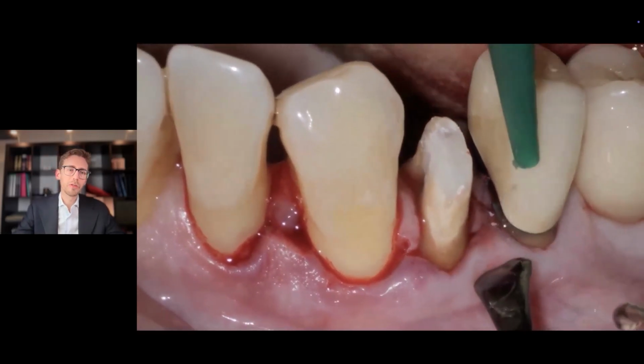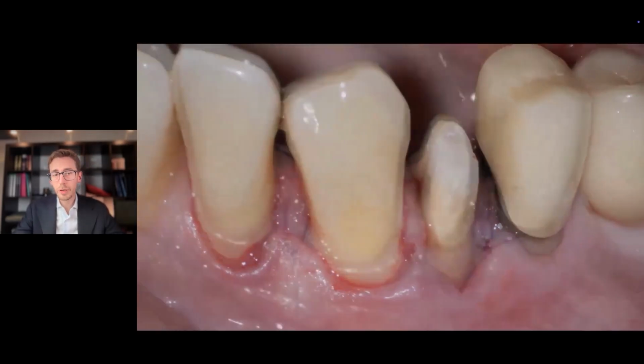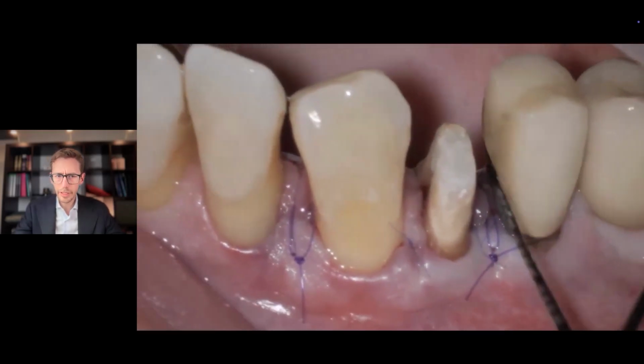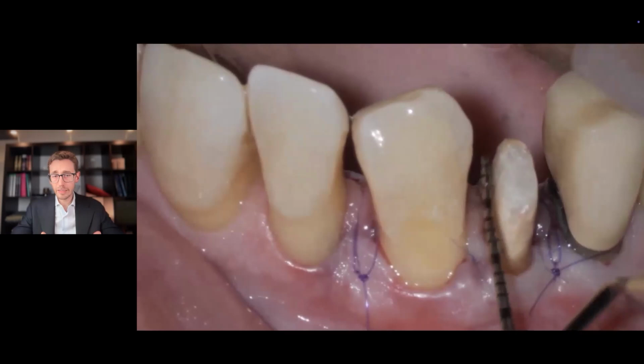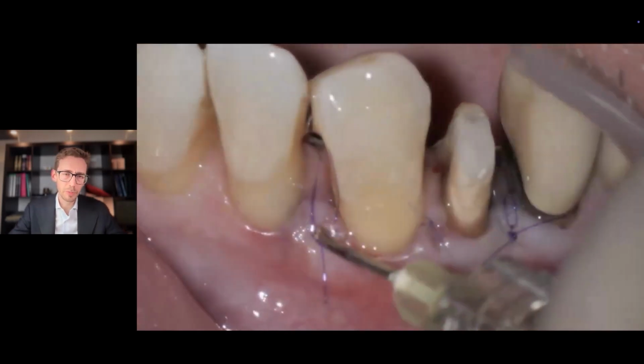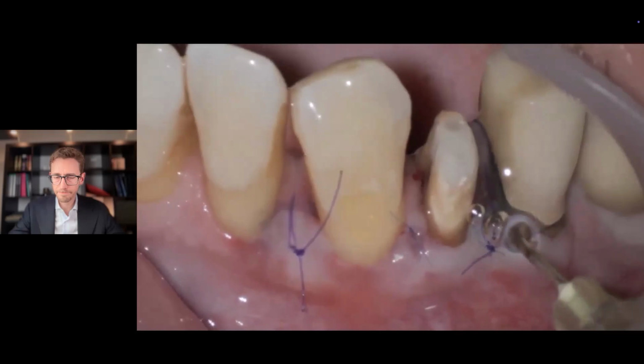Of course, both in the mesial and in the distal defect, once we perform the primary intention wound closure, in this case with the conventional Laurell-Gottlow sutures, we apply a final layer of RegenFast on top of the incision line in order to promote soft tissue healing.